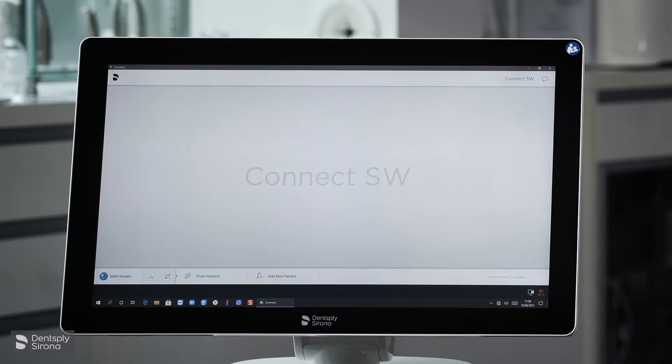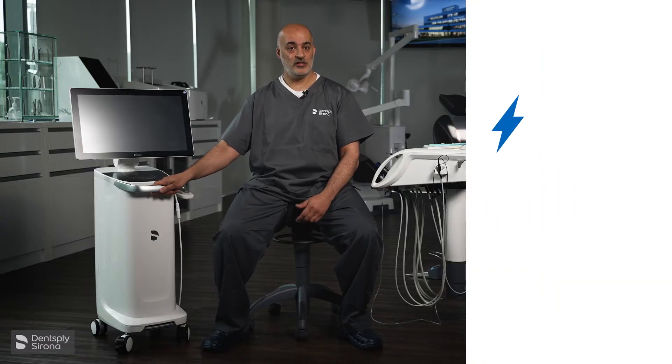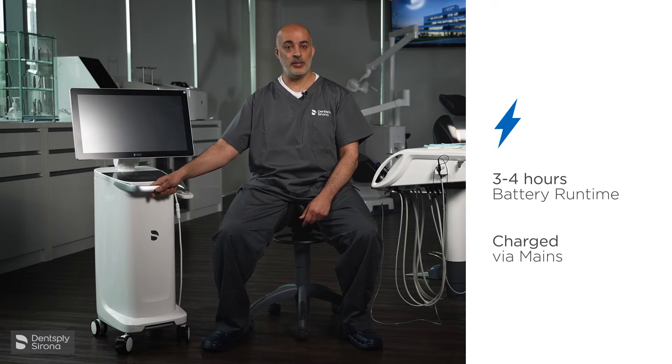The interface looks stunning. Another feature that I love about the Prime Scan is the fact that it has a battery pack and it runs for three to four hours. It can also be charged via the mains.